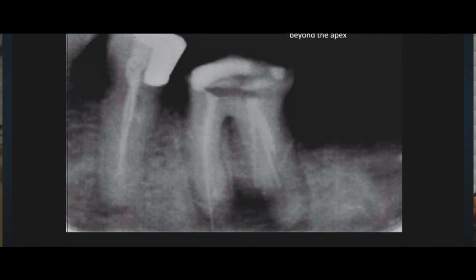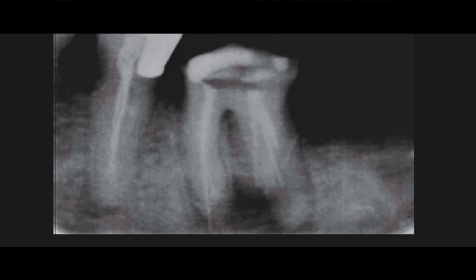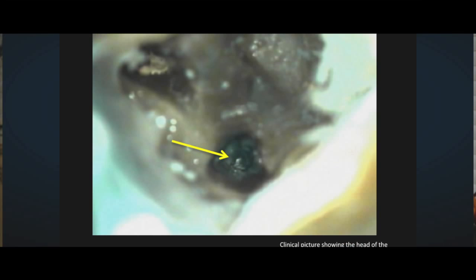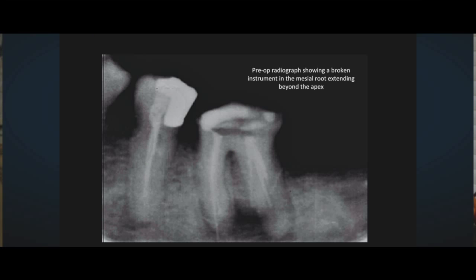At the beginning, I thought this was an over-extended single cone or something. But knowing that nickel-titanium alloys, especially when we have greater taper files, usually have almost the same radiopacity as described in the literature. Looking under the microscope, I found a shiny spot — a broken instrument. The mesolingual canal also had a bypass beside the broken instrument, and it extended to a perforation at the apical one-third, likely from a previous attempt at removing or bypassing the broken instrument.